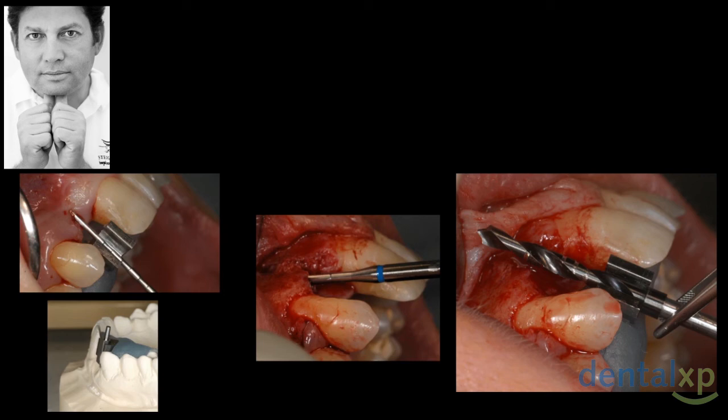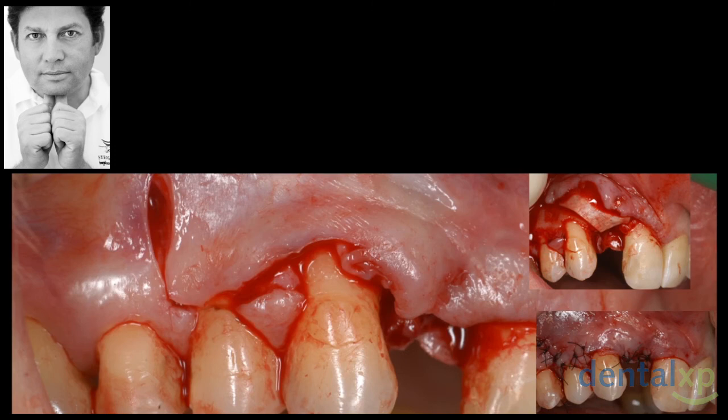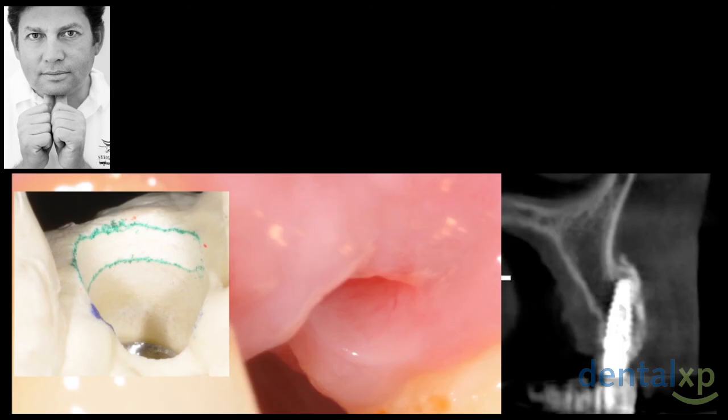Okay? Right? Or you have to graft it in such a way, like we do here, papilla-based incision, graft the procedure, suture it, and then what's very important, this is a prosthetically placed implant. And you have to be aware ahead of time, because if you want to have soft tissue development prosthetically, your implant has to be outside the envelope of bone. And the study we did at University of Michigan showed that 20% perforate the buccal plate if they are placed in position prosthetically. Connective tissue doesn't help.